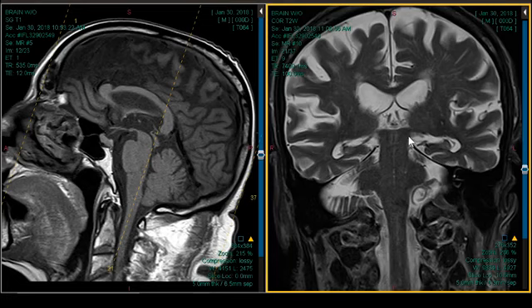We know that after age 60, somewhere between 5 and 10% of these individuals on a 5-year track will convert over to full-blown Alzheimer's disease. So MCI is not a diagnosis to be taken lightly, but it is a diagnosis to be made by the radiologist when you see those specific findings: parietal, temporal, entorhinal cortex, choroidal fissure, big temporal horn, not a lot of vascular disease. You have to introduce that into your report and into the differential diagnosis.